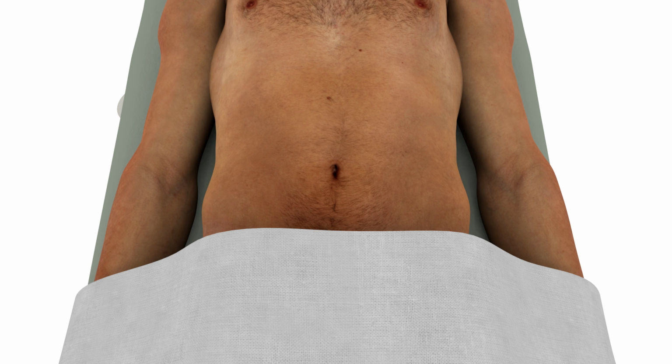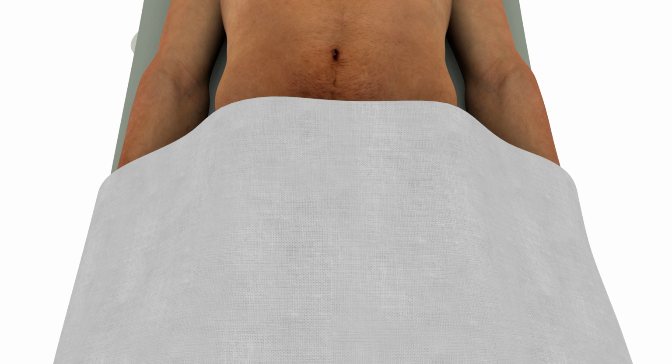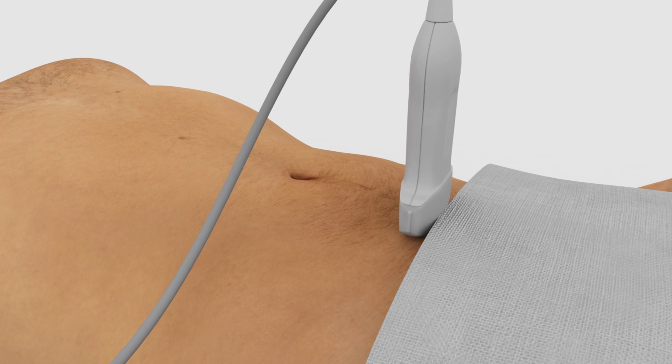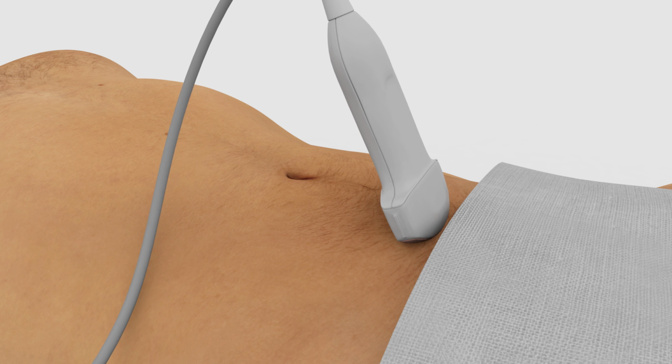As a starting point for the examination, the patient should be lying supine on the examination table. Place a sheet to cover the patient below the level of the pubic symphysis. To obtain a transverse view of the bladder, position the probe so that the probe marker is pointing toward the patient's right. The urinary bladder is a pelvic organ, so the transducer must be positioned just superior to the pubic symphysis and aimed into the pelvic cavity.